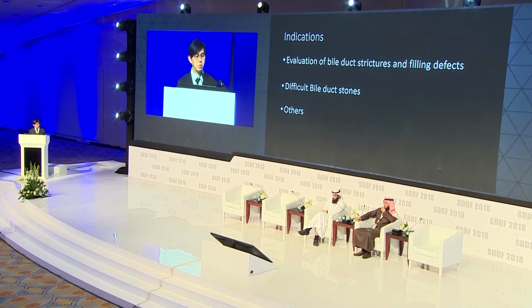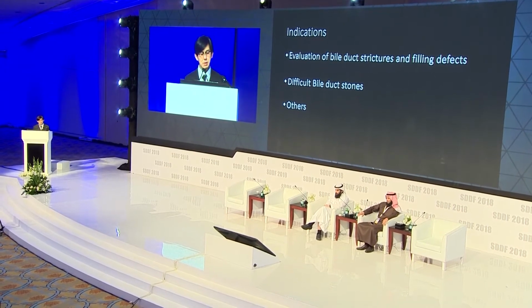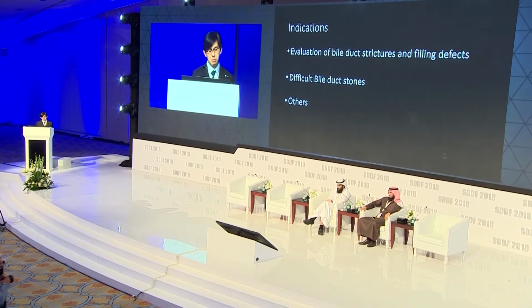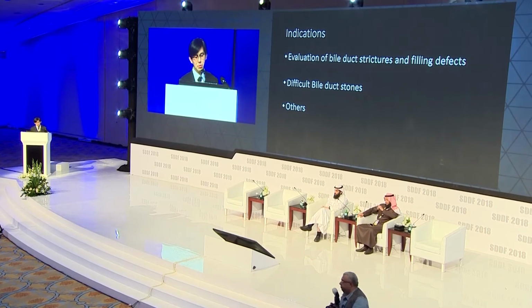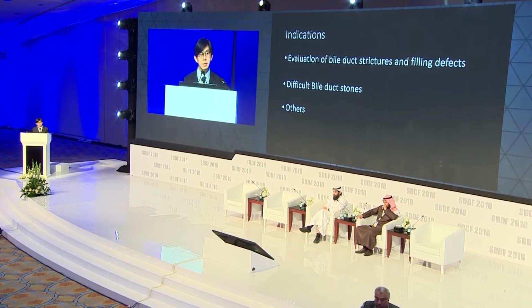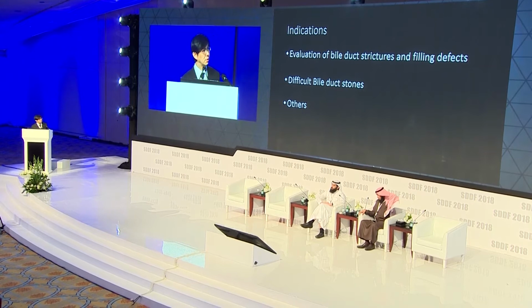I thought I would share with you some of our experiences. So we use digital Spy for a few purposes, mostly for evaluation of bile duct strictures and imaging filling defects within the bile ducts. We also use it to manage difficult bile duct stones, and we've used it for other indications such as management of trapped baskets with stones and so on. So I would like to show you some cases and then review the literature with you on the potential uses of digital Spy.